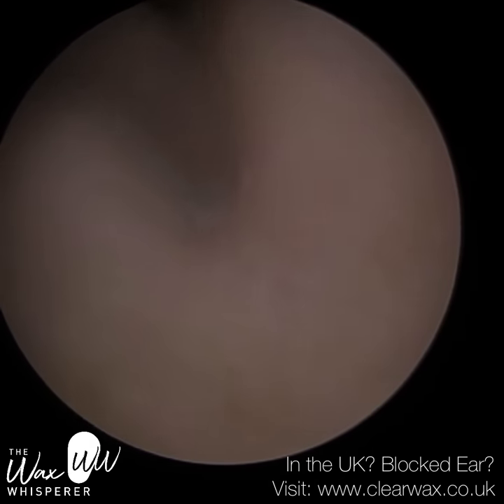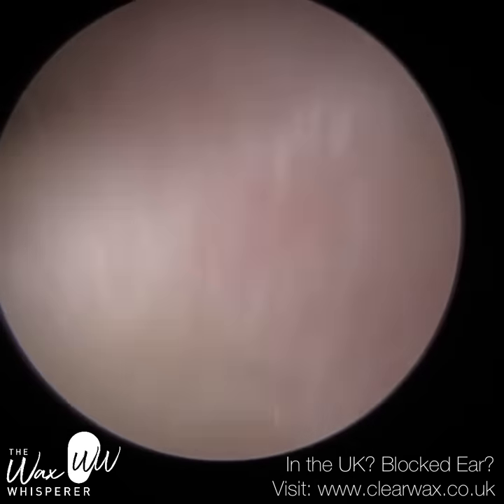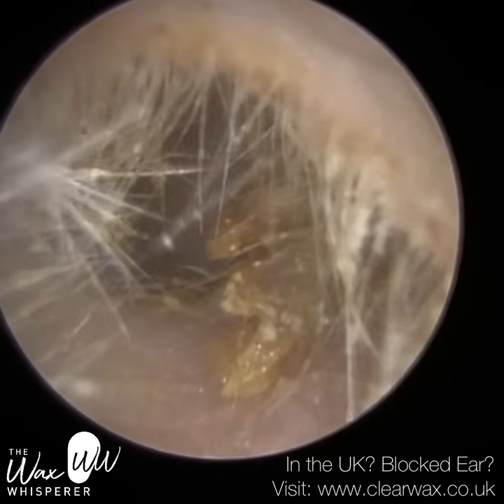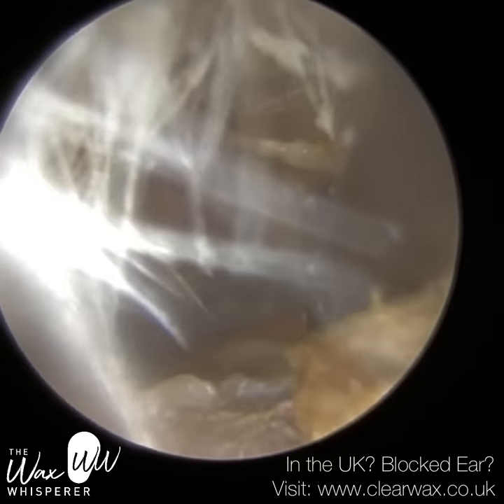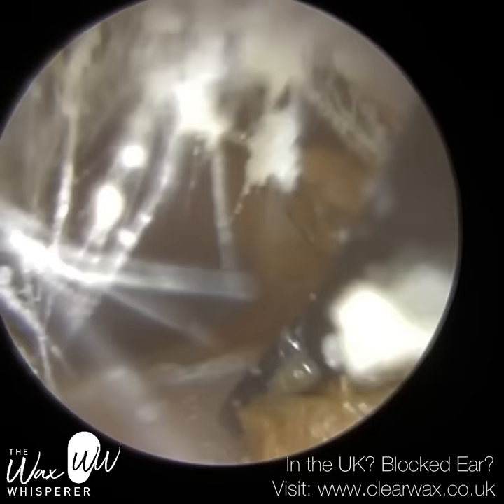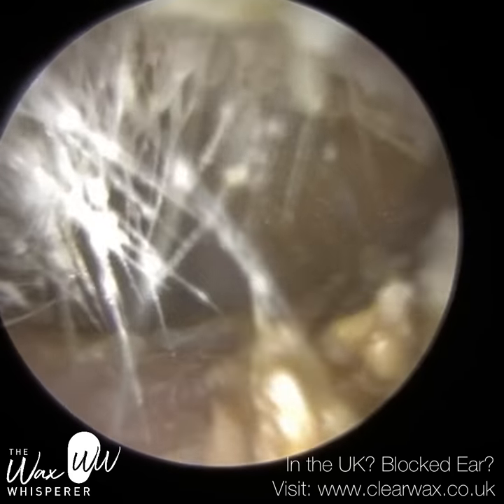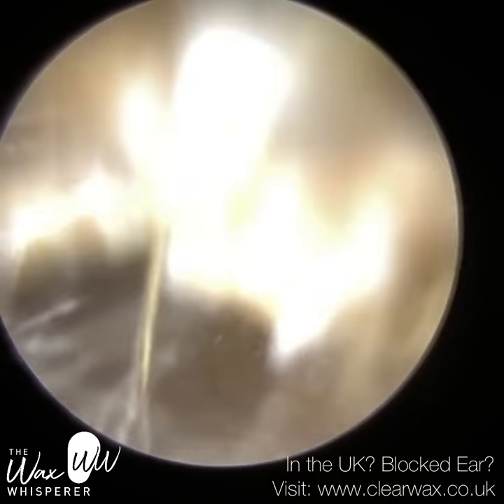However, upon re-inspection of the ear, the patient had a very thick, oxidised layer of dead skin that was lining the entire ear canal right up to the eardrum, and you can begin to see this skin here. I'm just using a Jobson horn to slowly bring this piece of skin out of the ear.